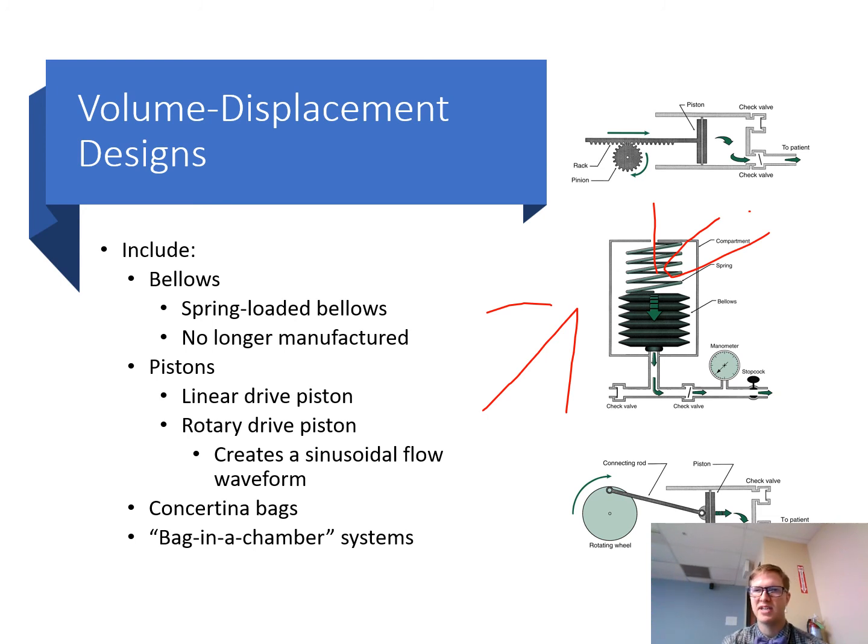You see that spring on top of the bellow that applies force per unit of area, or pressure, right? So force over an area that would tighten the spring and creates a greater force, therefore greater pressure. So that bellow would then contain pre-blended gas, your air and oxygen concentration, and that would be administered to the patient.